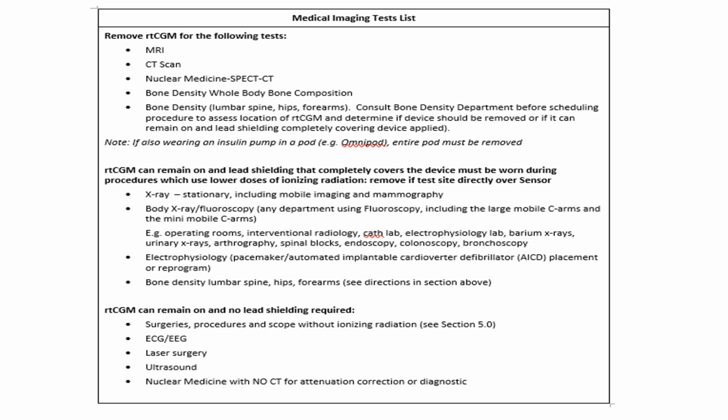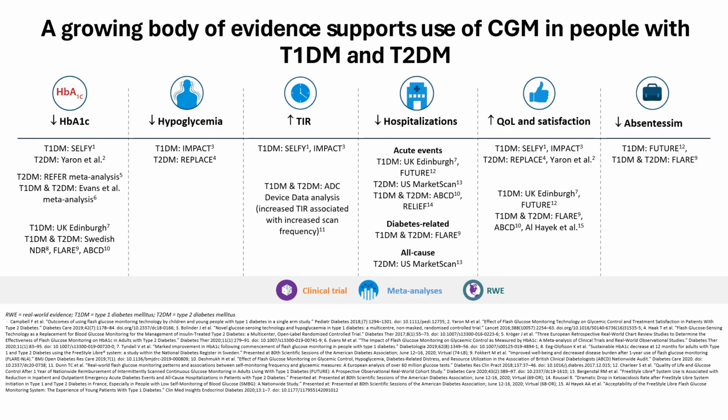And there is a growing body of evidence that supports multiple facets of diabetes benefits for people wearing CGM in both the type 1 and type 2 diabetes sphere. It definitely reduces the A1C because people are monitoring their sugars more closely. It can decrease hypoglycemia because it will give them an alarm or alert if it's turned on. And there's severe lows that you cannot turn off that alarm. So if they go less than 3, then this alarm will go off whether they turn the alarm off on their system or not. It can't be turned off.